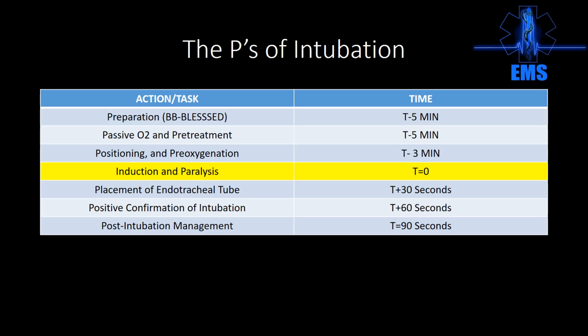I don't know if you guys remember the resuscitator. When I came into EMS, the resuscitator was big, and it was a pressure valve that the cops had on an oxygen tank. And by the time you got to the patient, there was vomit everywhere because the cops knew how to do one thing, and that was throw the resuscitator on and then fill the patient's esophagus up with plenty of air till they vomited. Made my job a whole lot more fun and hard.